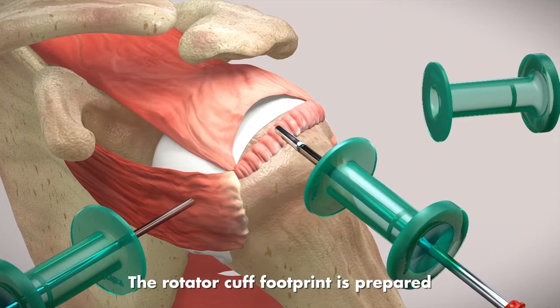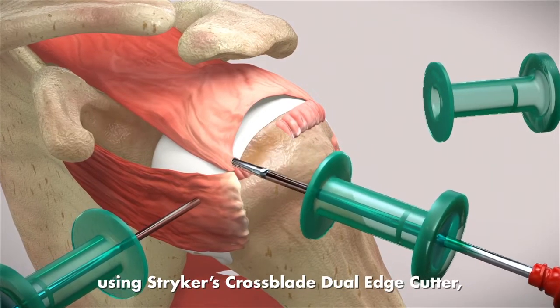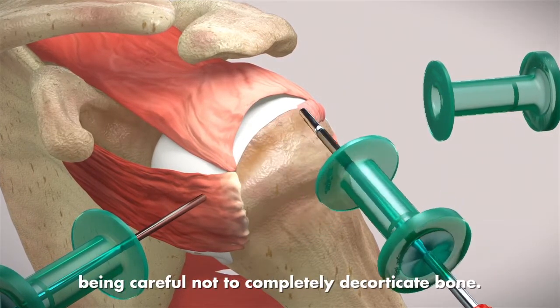The rotator cuff footprint is prepared using Stryker's cross-blade dual-edge cutter, being careful not to completely decorticate bone.